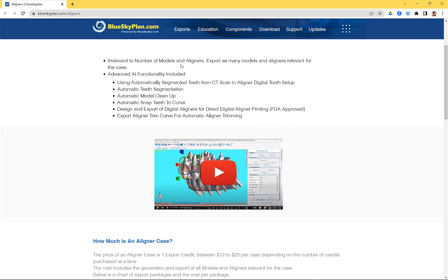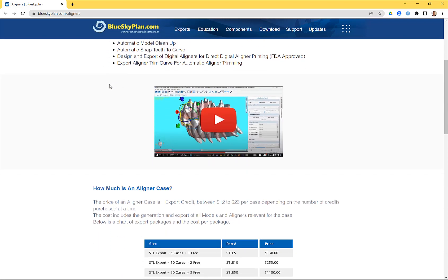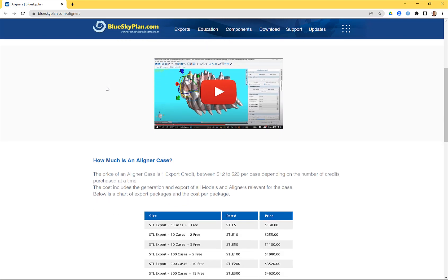The cost is irrelevant to the number of models and aligners — export as many as are relevant for the case and it's all included in that one export credit. All of our advanced AI functionality is also part of it: automatic tooth annotation, segmentation, segmenting CT teeth from the CT scan and automatically aligning it to the segmented teeth from the model, model cleanup, snap teeth to curve, the ability to design the aligners themselves and export STL files (now FDA approved in Blue Sky Plan), and the ability to export the liner trim curve for automatic liner trimming. All functionality for aligner planning is included in the one export credit.